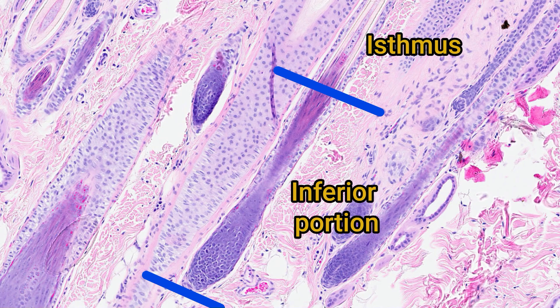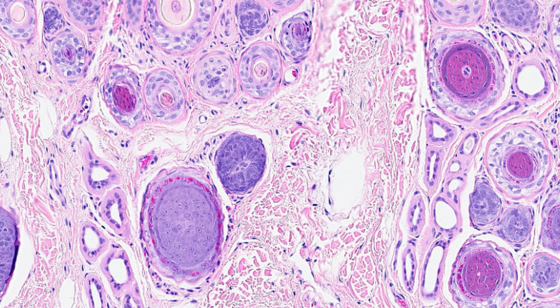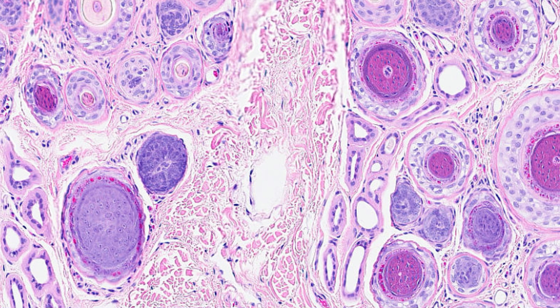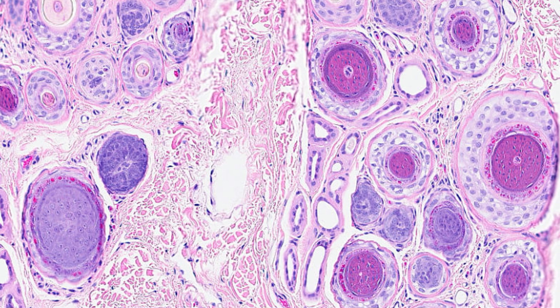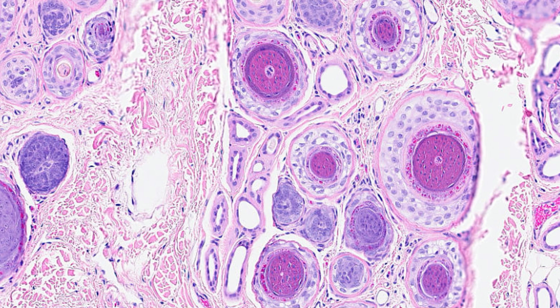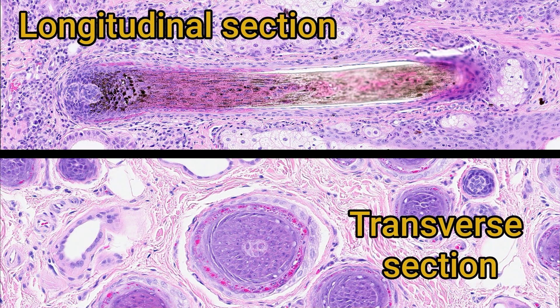The inferior portion extends from this junction to the hair bulb at the bottom of the hair follicle. The appearance of the hair follicle changes depending on whether the hair is actively growing or not. Let's start with the appearance of a hair follicle in anagen phase, the active growth phase, so most of the features of the hair follicle are visible. Most of the images shown are transverse sections through a hair follicle.